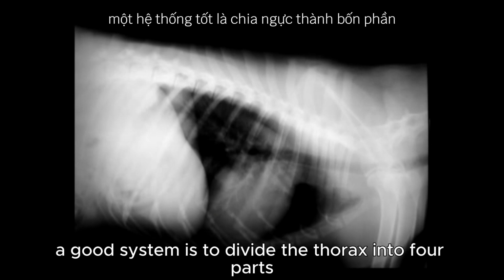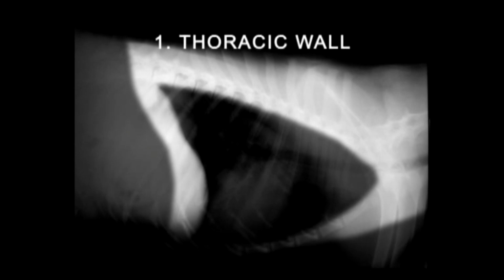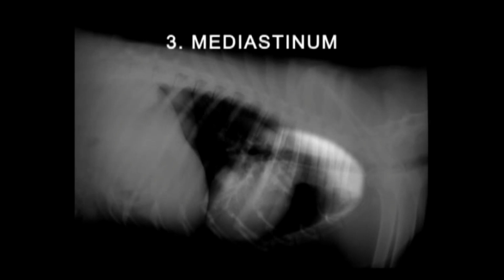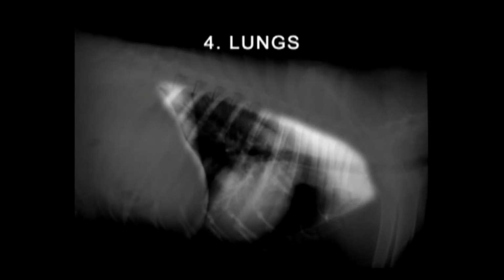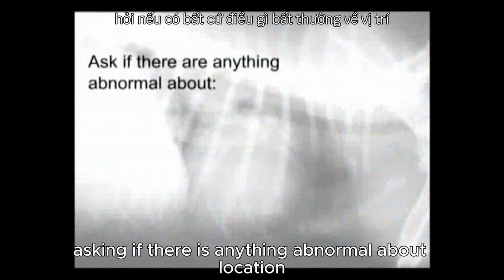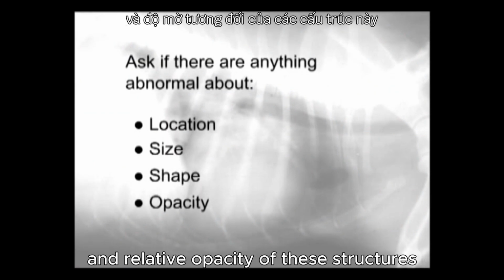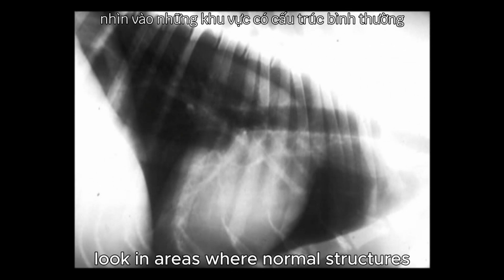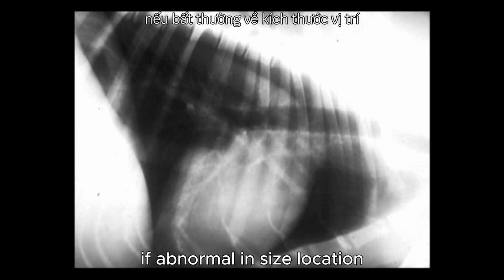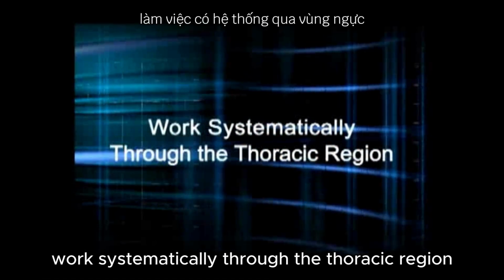A good system is to divide the thorax into 4 parts: thoracic wall, pleural space, mediastinum, and lungs. Start with the thoracic wall and look at all structures always in the same order, asking if there is anything abnormal about location, size, shape, and relative opacity of these structures. Look in areas where normal structures cannot normally be seen, but can sometimes be seen if abnormal in size, location, or relative opacity. Work systematically through the thoracic region.